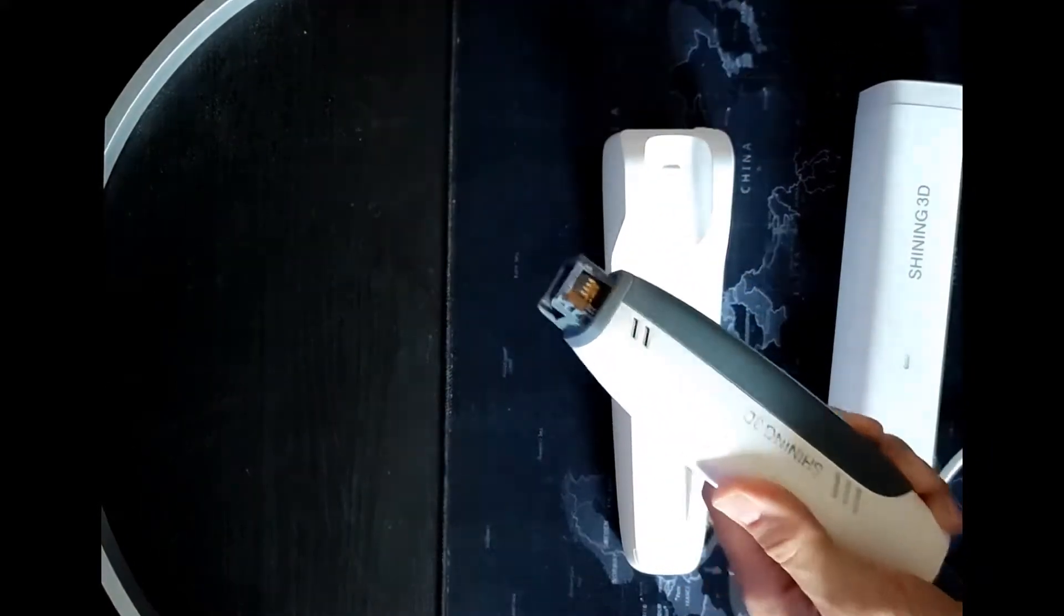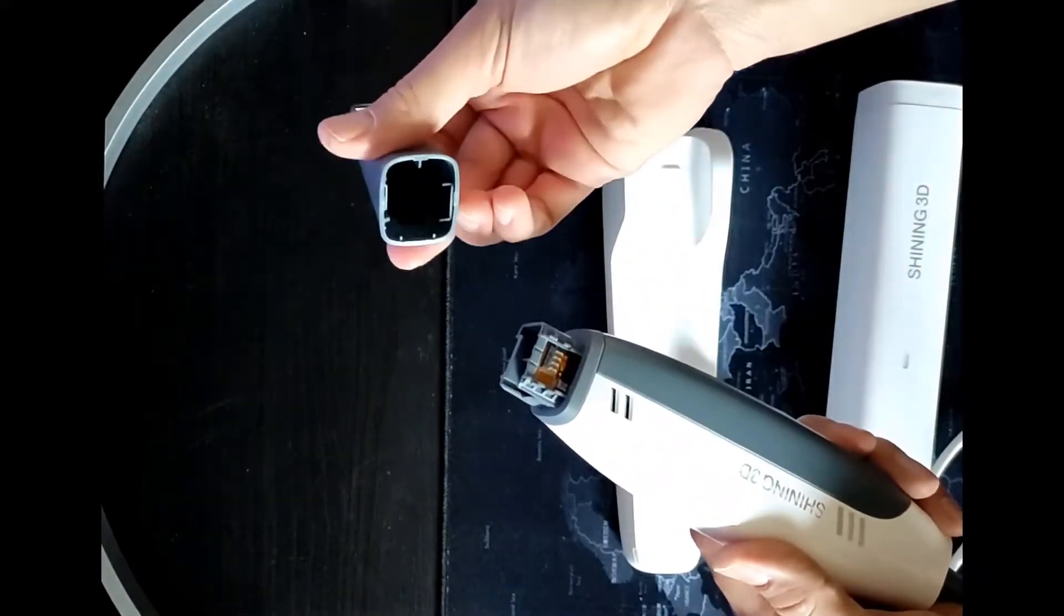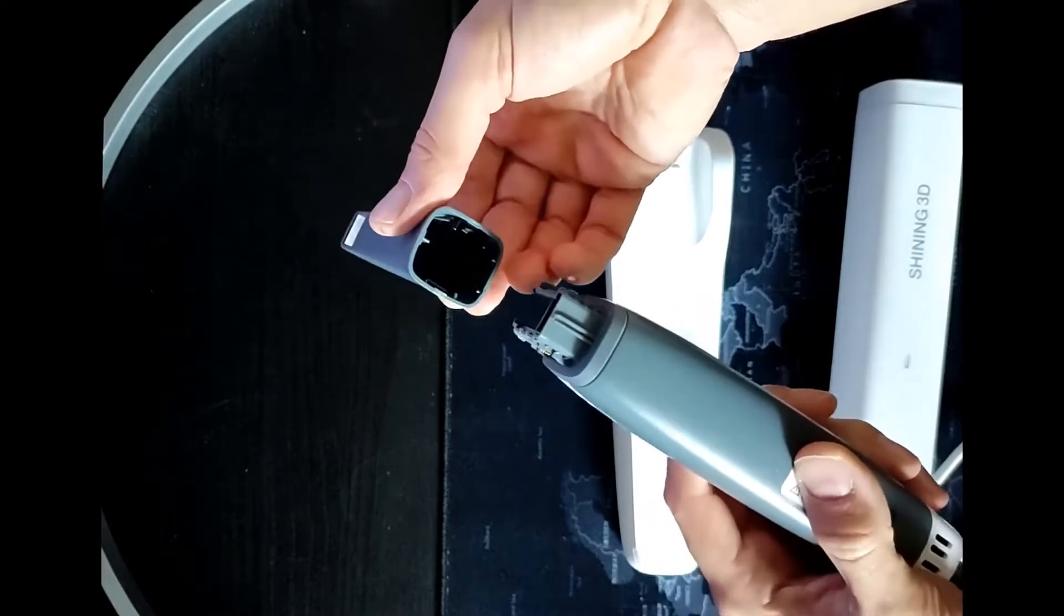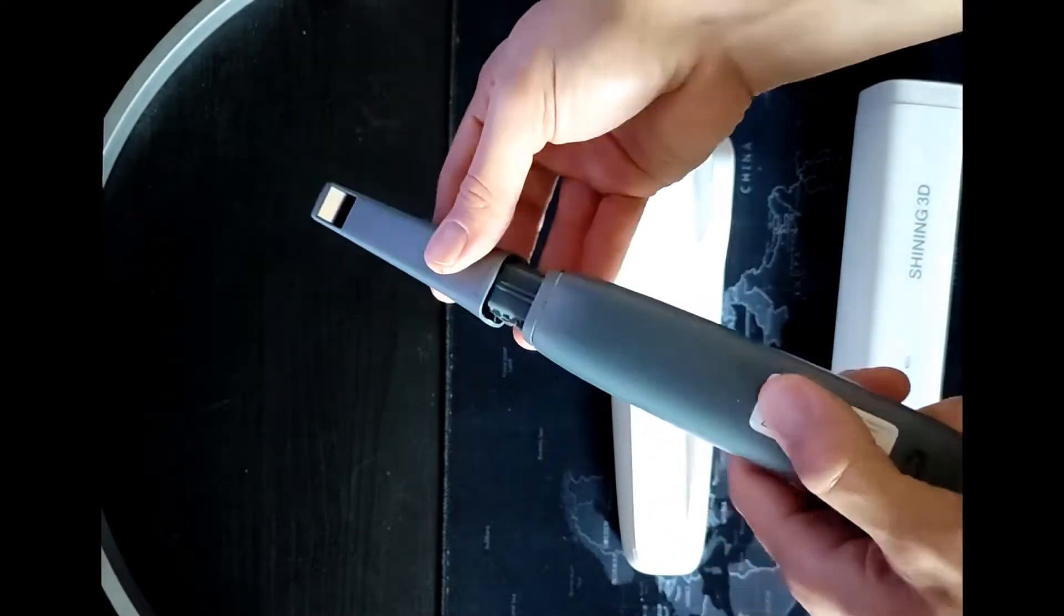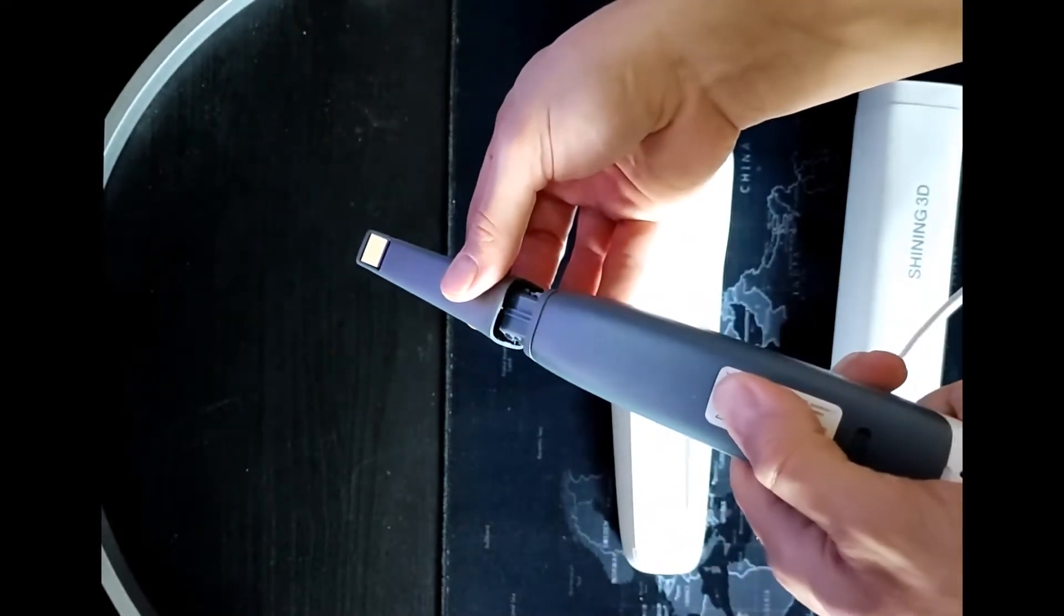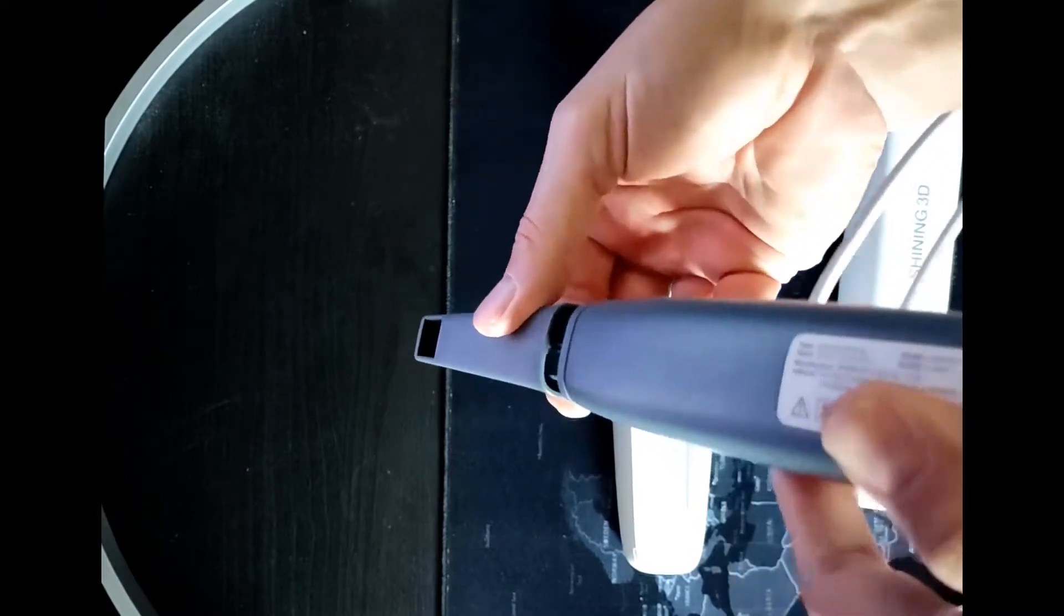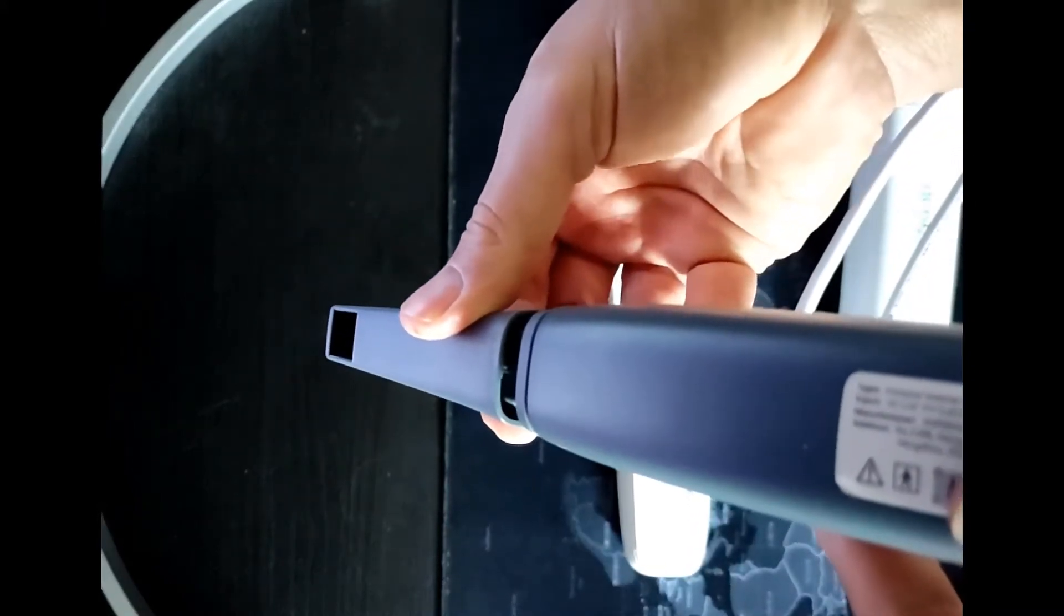You can remove the protection of the scanner head and insert the tip in the right way. Take care of the correct insertion direction.